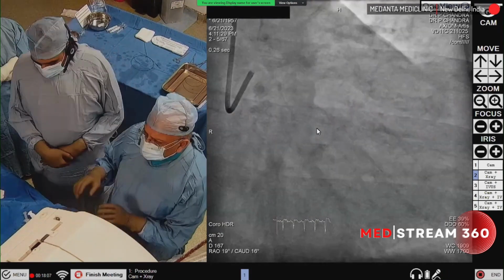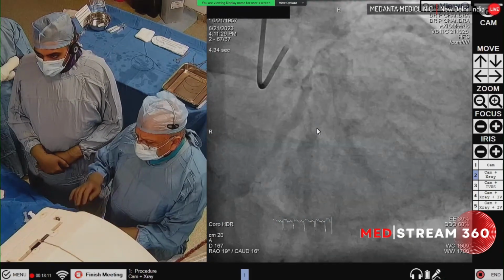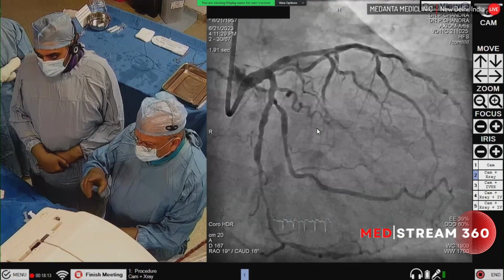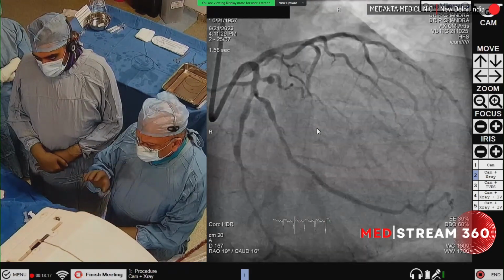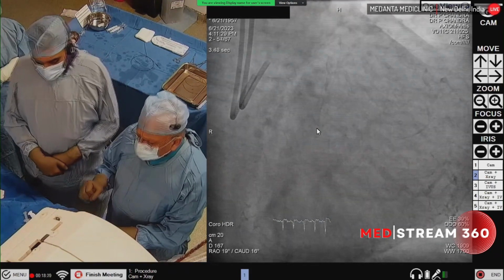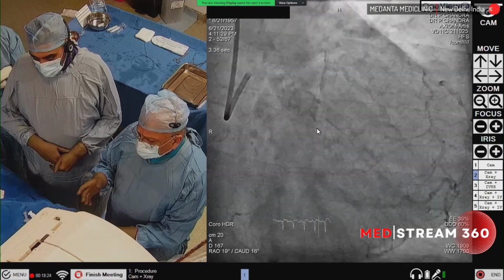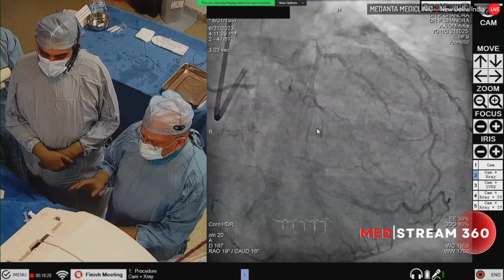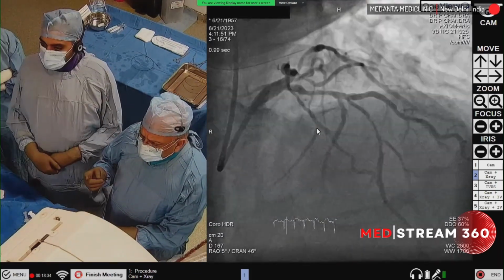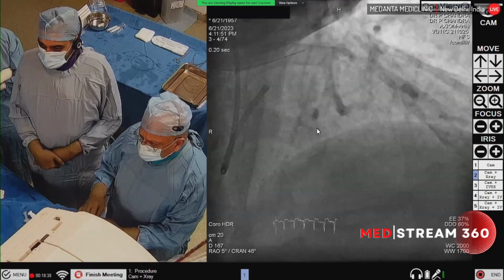Okay. So here you see that on angiogram we have a long disease in the LAD. There is a disease in the first OM, which is a very big OM, and then the distal circumflex is having some narrowing in the range of about 50-60% and maybe up to 70% at some places. The right artery is non-dominant, but it is having some disease. So you can see that the LAD is the tightest lesion, which is creating this symptom.